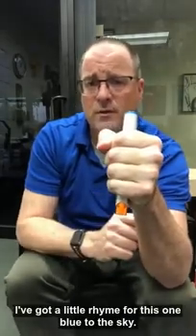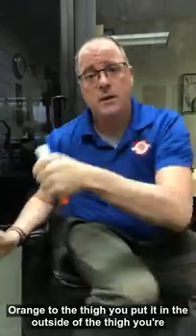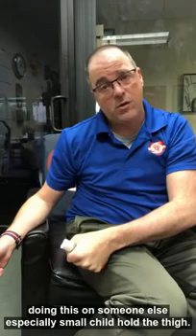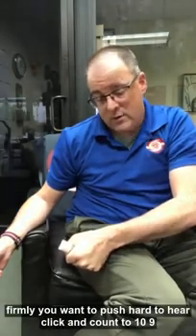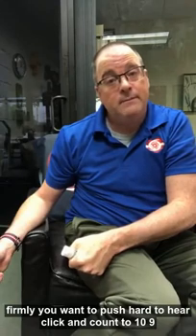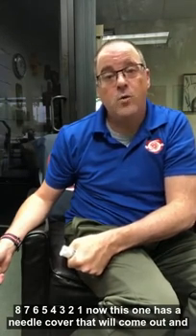I've got a little rhyme for this one. Blue to the sky, orange to the thigh. You put it in the outside of the thigh. If you're doing this on someone else, especially a small child, hold the thigh firmly. You want to push hard till you hear a click and count to 10. 9, 8, 7, 6, 5, 4, 3, 2, 1.